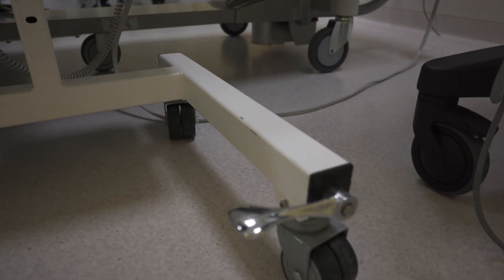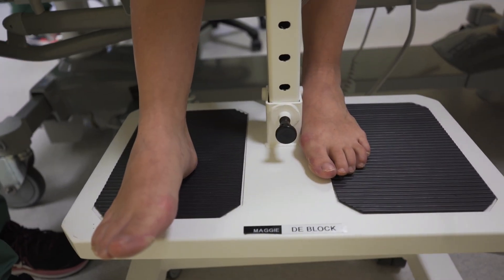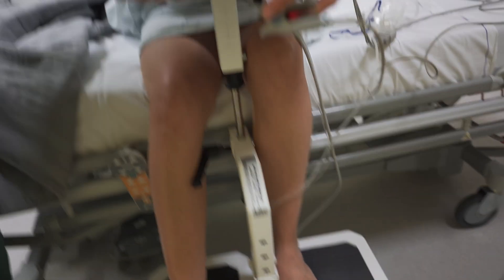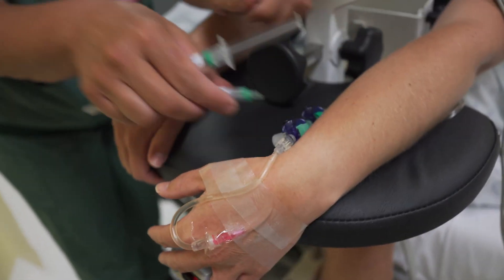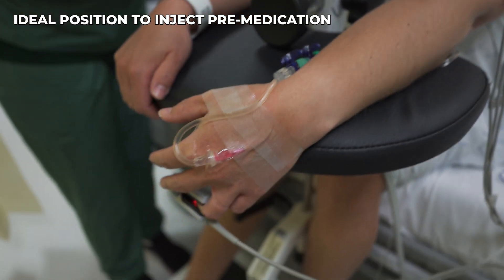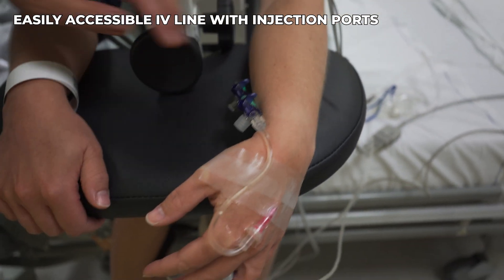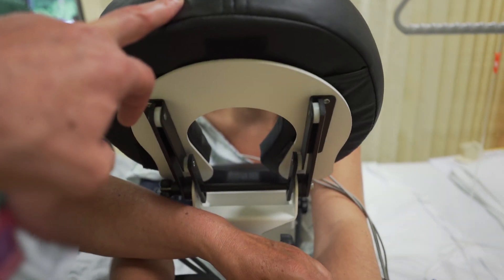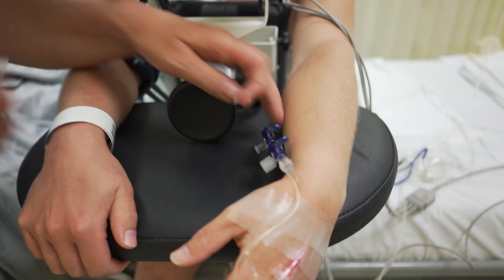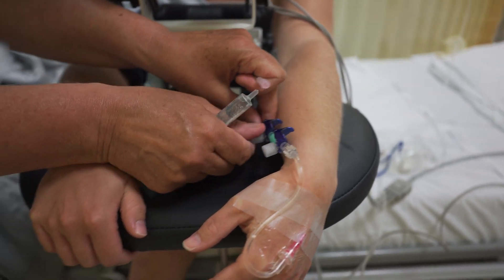Here we can see the brakes — they're very important to place. The feet are comfortably placed according to the patient's tolerance. The hands are placed on a little standee, the arm rest. You can see how convenient it is to administer any medications through this. The patient's head goes on the head rest up here, and once the patient is comfortable, we can complete the setup.